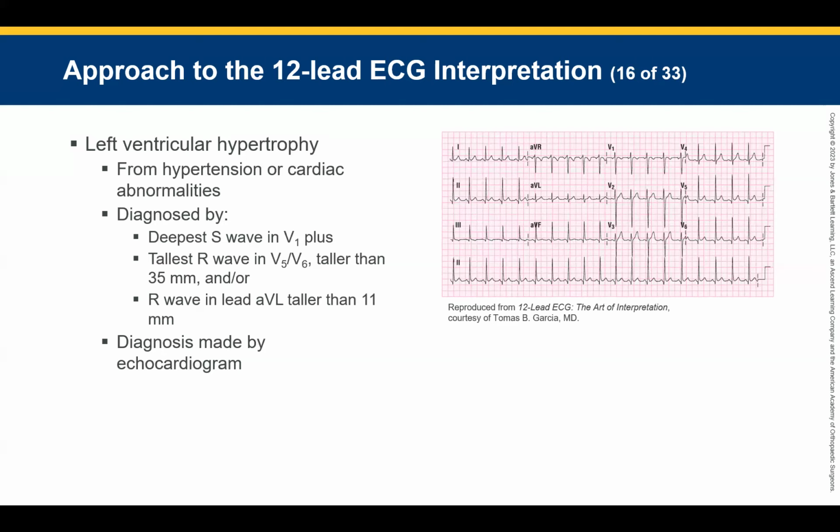We are missing one. aVR, we're just gonna kind of put an X at, that's a next week problem. That does not immediately identify STEMIs. It does help us out in the future in some more advanced cardiology. This is beginner cardiology. So aVL is the lateral. Lead 1 and aVL are lateral. V5 and V6 are lateral.